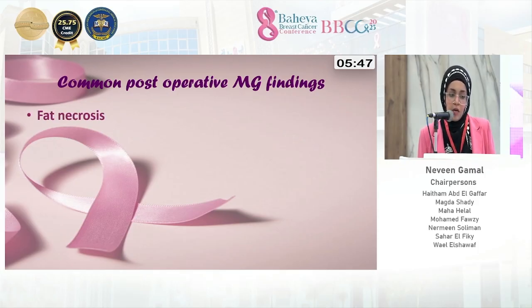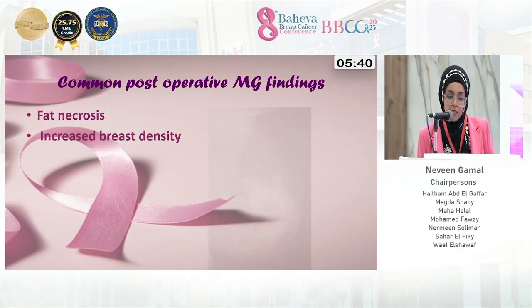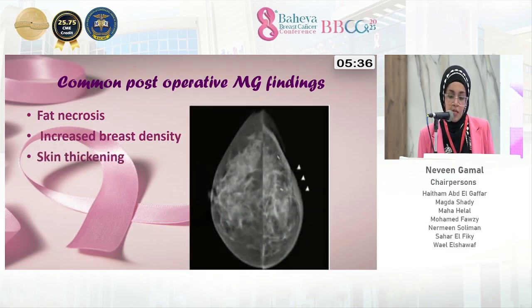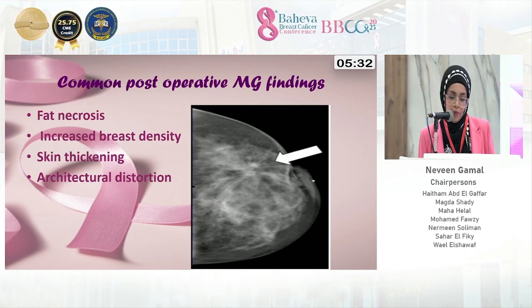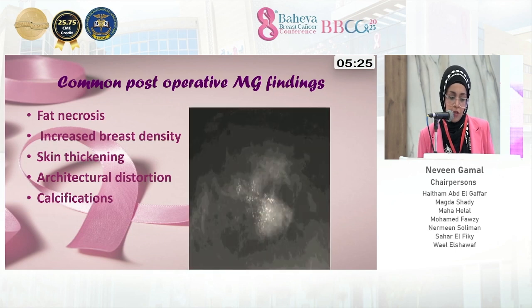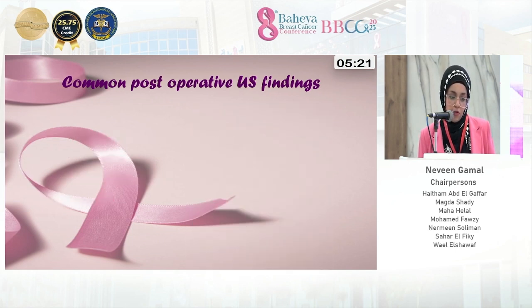Let's see common post-operative mammography findings. We have fat necrosis, increased breast density, especially with edema, skin thickening, architecture distortion, either from operative bed scarring or in suspicious lesions, calcifications, which may be microcalcifications or macrocalcifications.